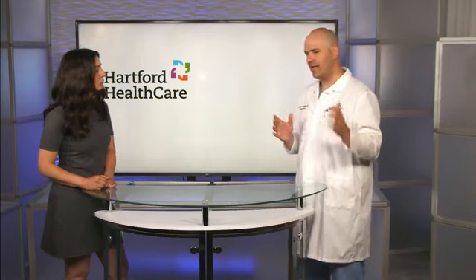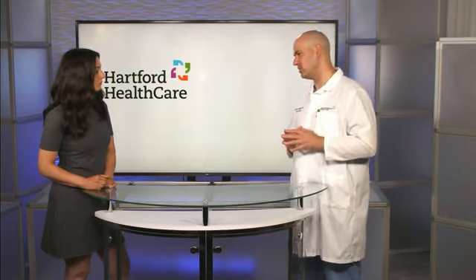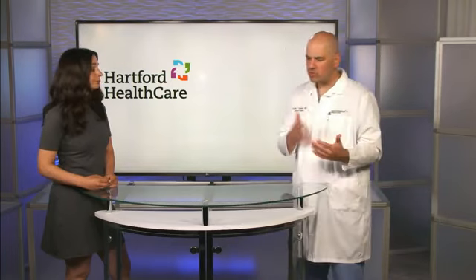So, not to say that the traditional needle biopsy with CT guidance doesn't have a role. It certainly does, but given the improved safety profile of this device and the excellent patient experience, and then we can also diagnose and stage the cancer in the same setting, there's more that we can bring to bear. But then also, this is just another tool in our toolbox that we can bring to bear in treating patients' lung cancer as well.